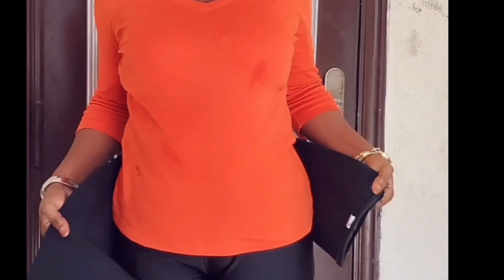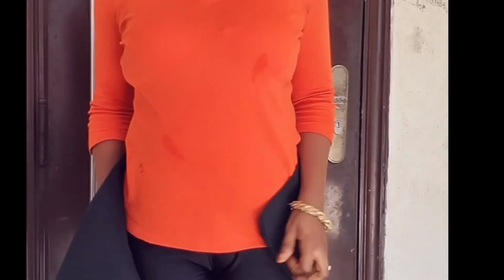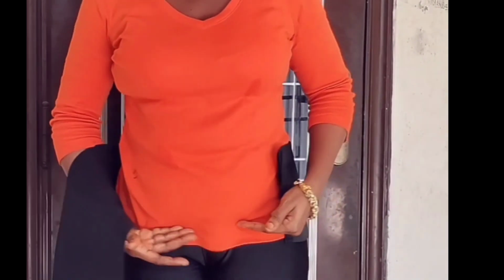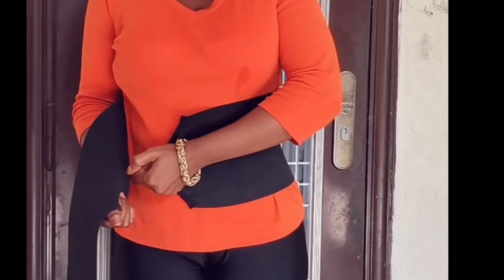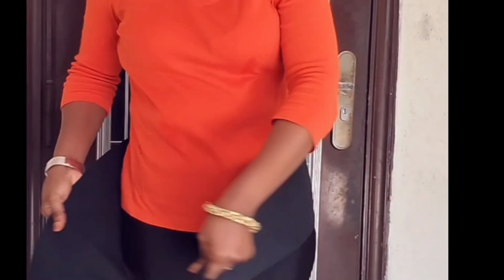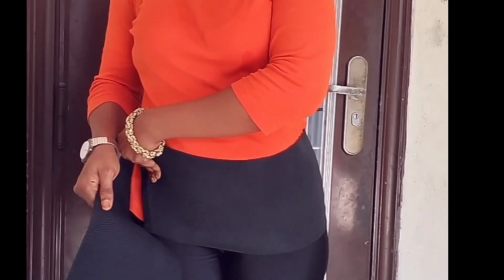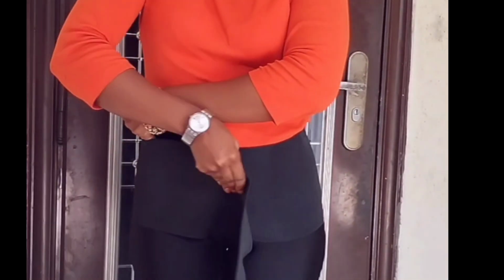The first thing you must do when using this belly wrap is to ensure that it is not over the incision. The incision will be somewhere here. So since your incision is somewhere here, don't put the belly wrap on top. It must be around it. So you are starting the wrap from your hip, so that it doesn't press down on the incision and is not on top. To press down on the incision, okay?